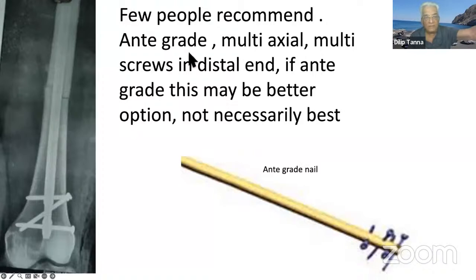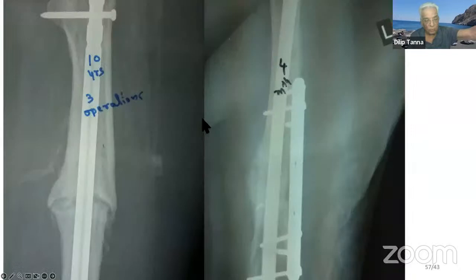A few people feel that an antegrade nail with multi-axial, multiple screws in the distal end may be a better option. I don't think that is true all the time. All such fractures, ultimately, when they don't heal up, need the graft.